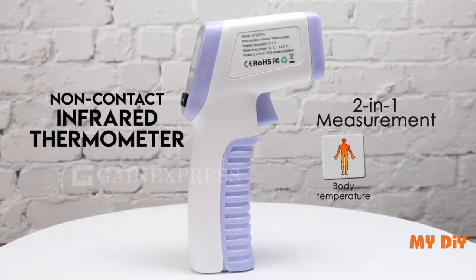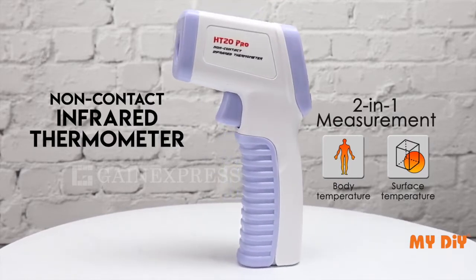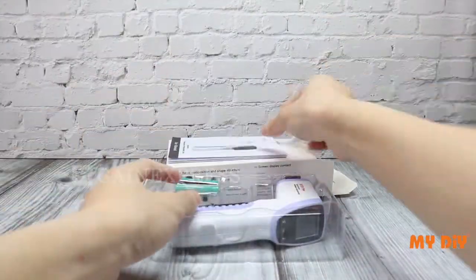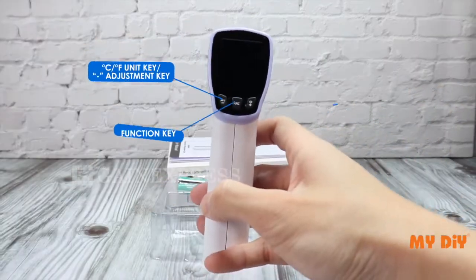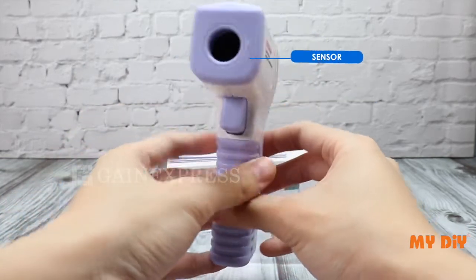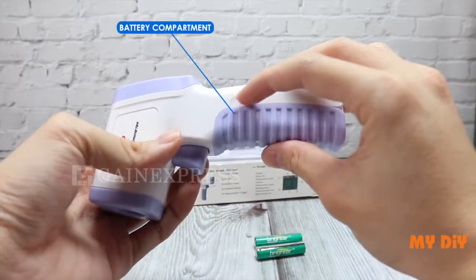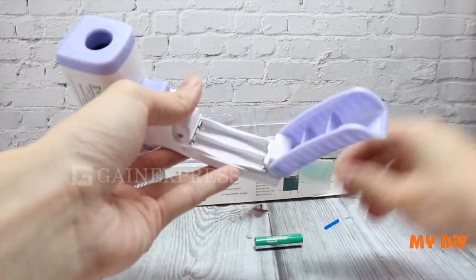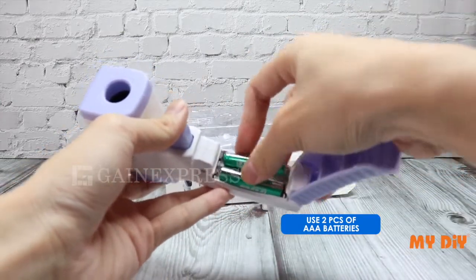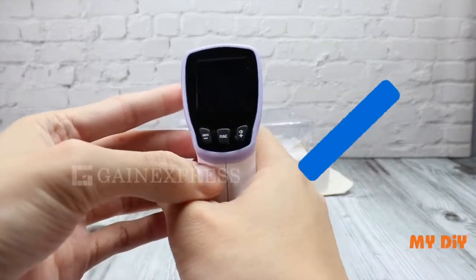This HT20 is a two-in-one body and surface non-contact thermometer. To operate, open the battery cover and load two AAA batteries. Pull the trigger to start up the meter.